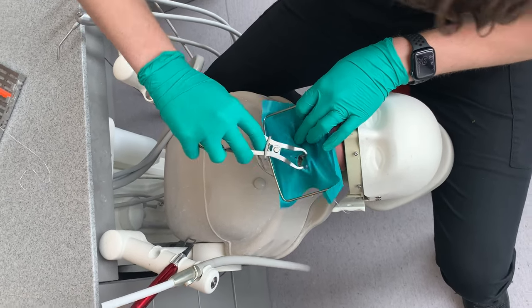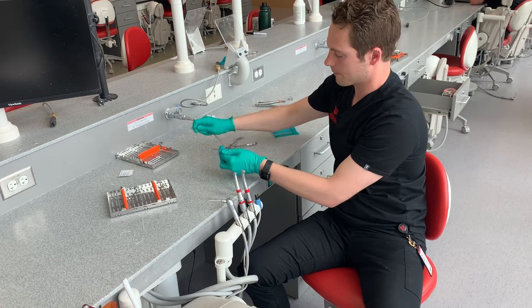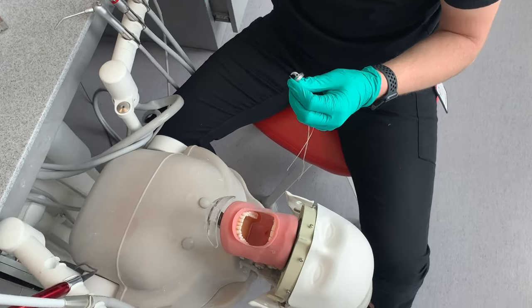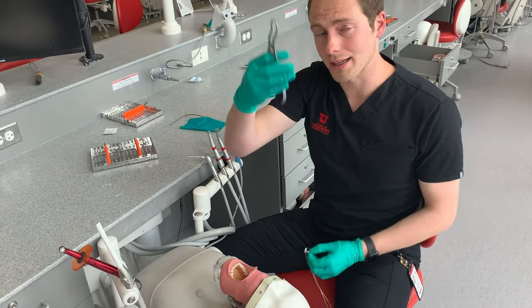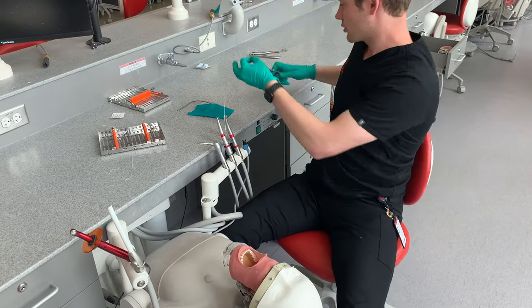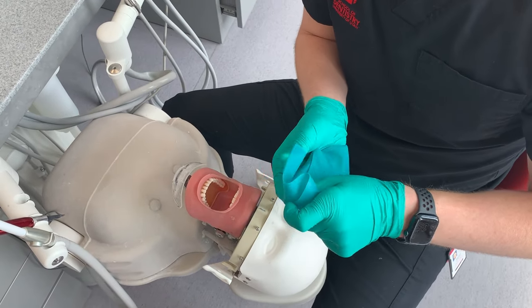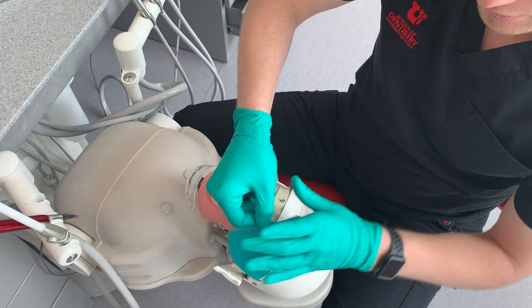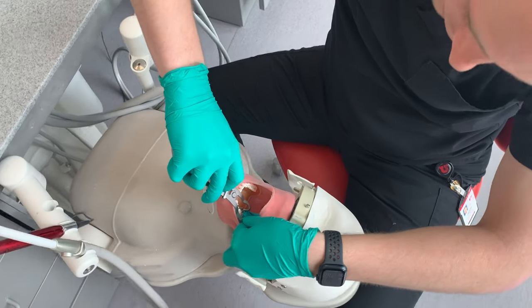The second option is to take our rubber dam off the frame and place it on without the frame. The reason this is beneficial is that sometimes when you're working on the most distal tooth, the ramus will get in the way and hit right there and you simply can't stretch it behind that. So what we're going to do is take our rubber dam, put the arch through, reflect that — now we have this placed on the tooth.